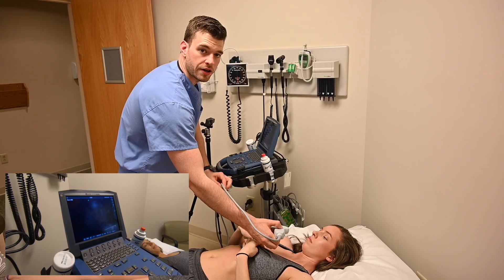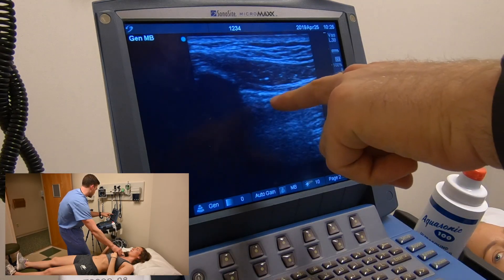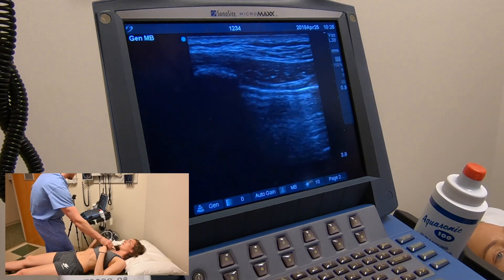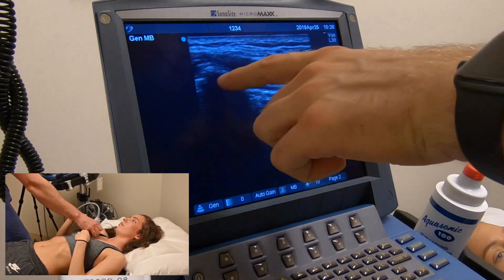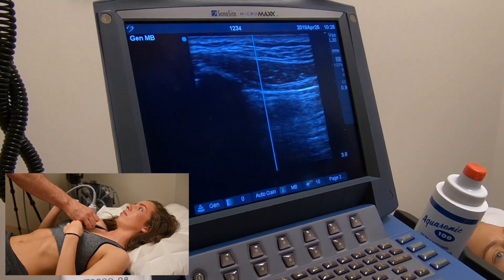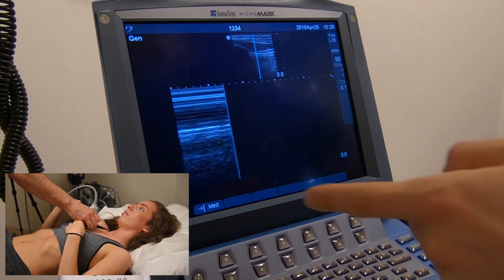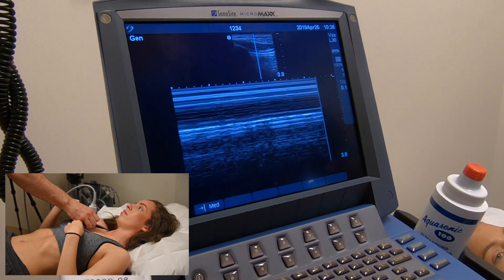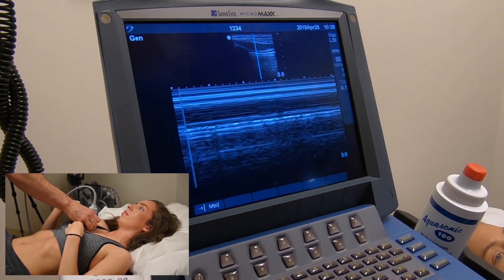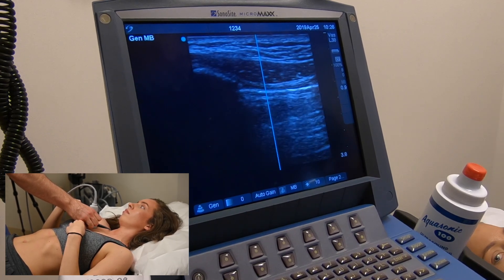Here we're looking at the lungs; I've switched to a linear probe to show the lung exam. Take a deep breath, Stephanie — you can see that shimmering motion, like ants on a log. That's a classic positive sign. This is a rib here, and we can't see sound waves past it. Just real quick with M-mode: place it over that region, hit M-mode, and you'll see the sandy shore pattern — like the shore and the water. If you saw a barcode sign instead, that would indicate a pneumothorax. I don't use M-mode a ton, but it's another way to assess that.